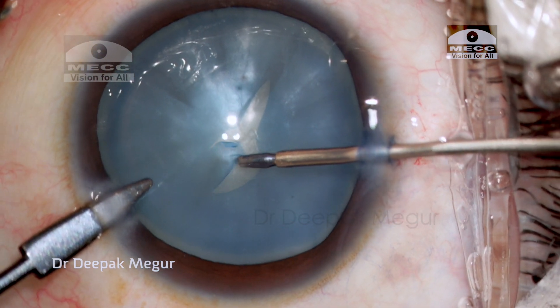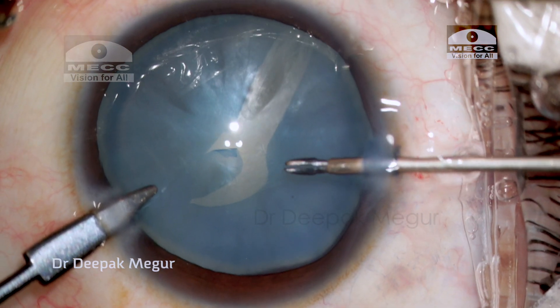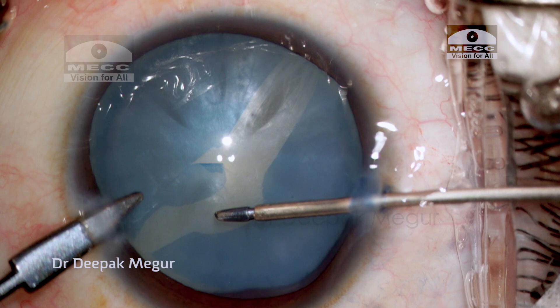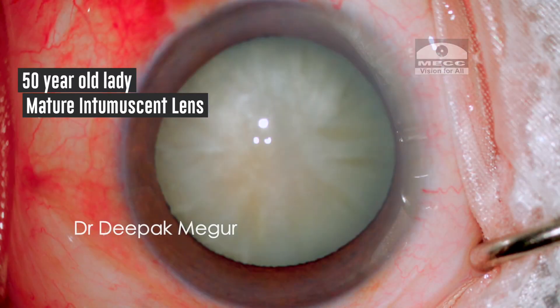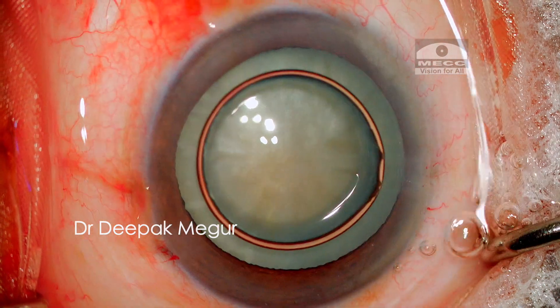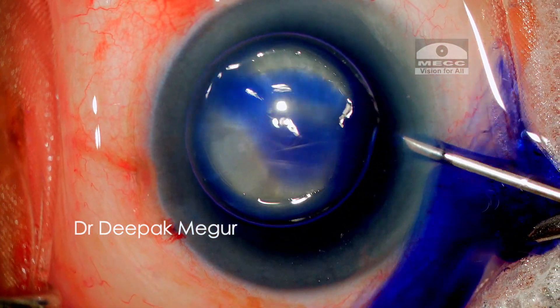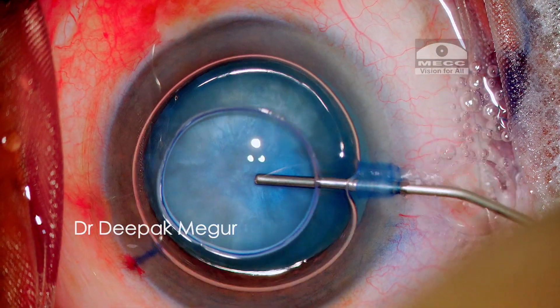During surgery, we can identify the group depending on how the lens behaves when we puncture the capsule. Today we have an eye with a very shallow anterior chamber, as evidenced by the A-scan biometer. Clinically, it does not appear to have any liquid cortex — the cortex is more like a jelly. My strategy is to perform a two-stage rhexis.